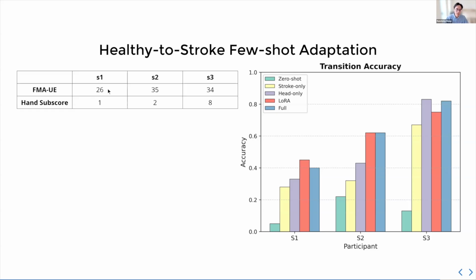Whereas S1 is our most impaired subject, and you have the lowest accuracy. So I think the story here is that if you're closer to healthy, healthy pre-training will help you more. And if you're more impaired, you might need more data or some other methods to improve your performance. But it's still better than if you train only from stroke.